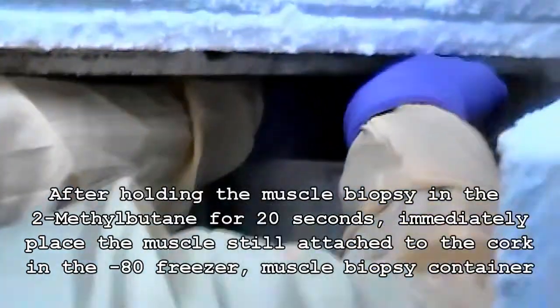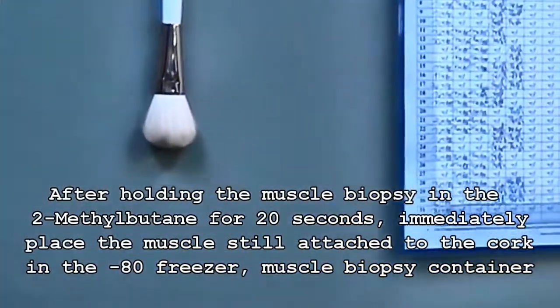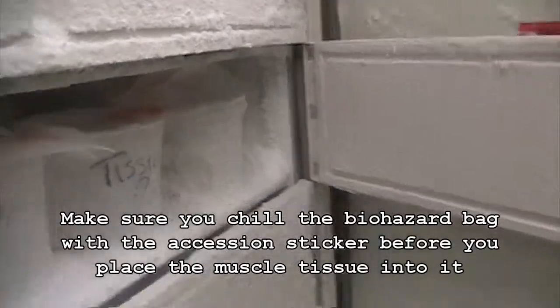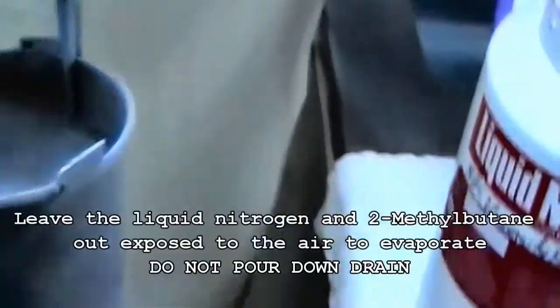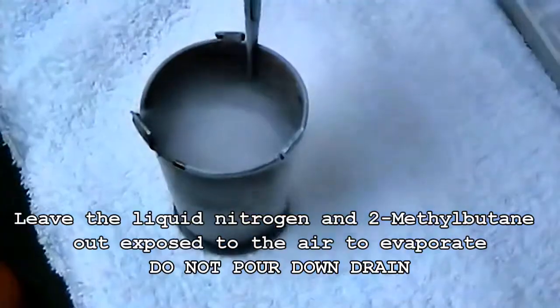Neuropath. And just put it in their bucket because it's labeled. Okay. Put it in the bag. Put the bag in the freezer for at least 5 to 10 minutes, and then come back and put your specimen in the bag so it doesn't melt the specimen. And then you just let this open to air, let it dry.